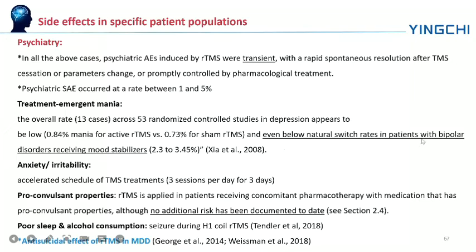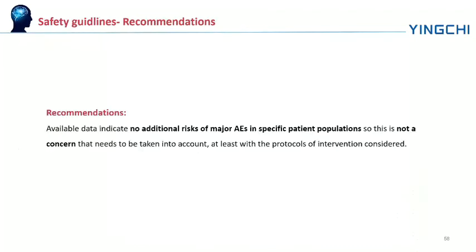And as for the patients with anxiety, it may cause some anxiety and irritability problems, mainly caused by the accelerated schedule of TMS treatments. It has 3 sessions per day for 3 days. So this is maybe too intense for these patients. And so the recommendations from the safety guidelines indicate that there is no additional risk of major AEs in specific patient populations. So this is not a concern that needs to be taken into account.